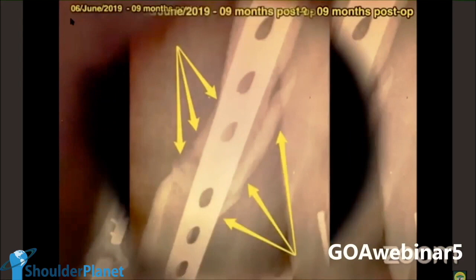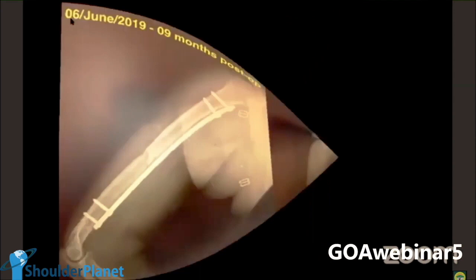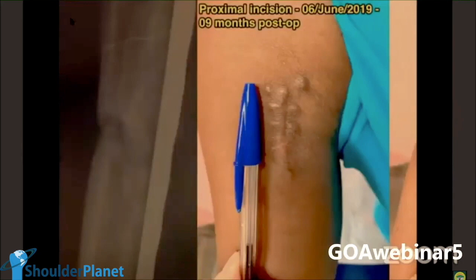And if you keep on following these patients, the callus will get better, because this is Rockwood, Campbell, Jupiter: remodeling takes months and years to happen. So this is the left view. I discharged her on that day. Proximal incision, distal incision. And how was the lady, the 68-year-old lady?